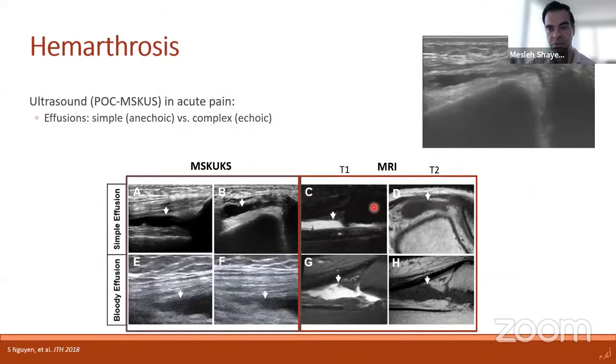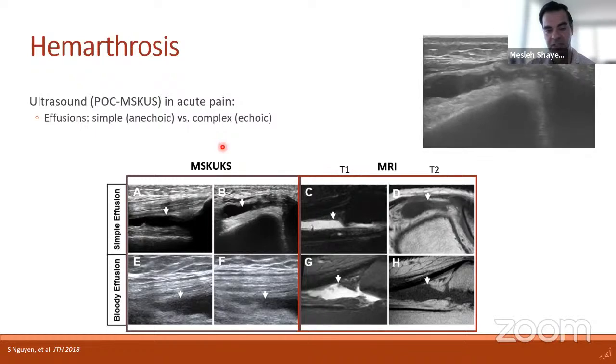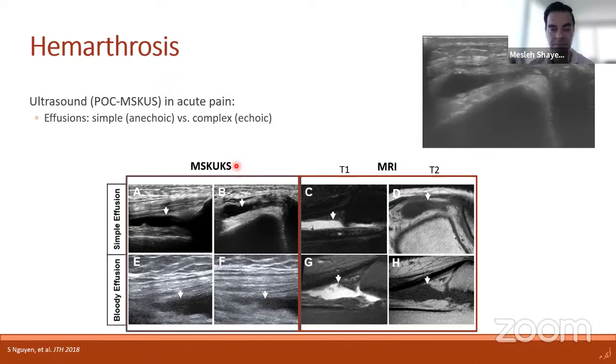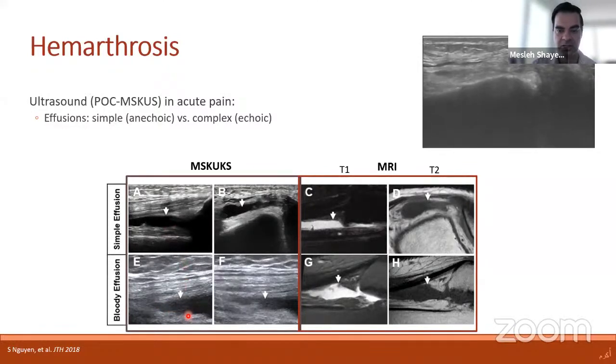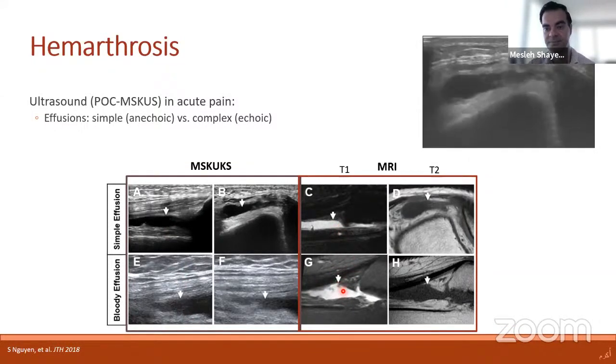Another advantage of ultrasound is it allows distinction of simple effusions versus complex effusions, meaning distinguishing if there's fluid that is from blood, from bleeding. So here, for example, in a simple effusion, you can see that it is anechoic, meaning it's completely black, versus here, it's a bloody effusion. In an ultrasound image, it's echoic, which is kind of hazy, if you can see the difference between here and here. Versus in the MRI, that distinction is much more challenging.